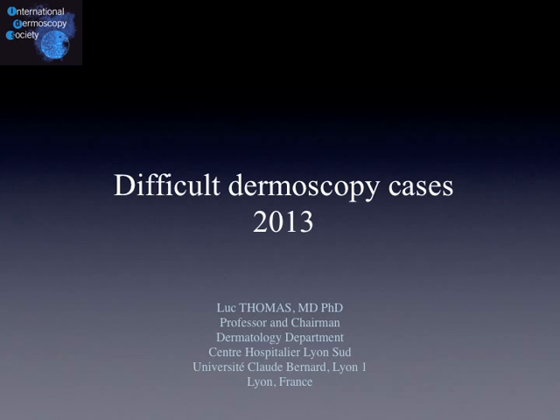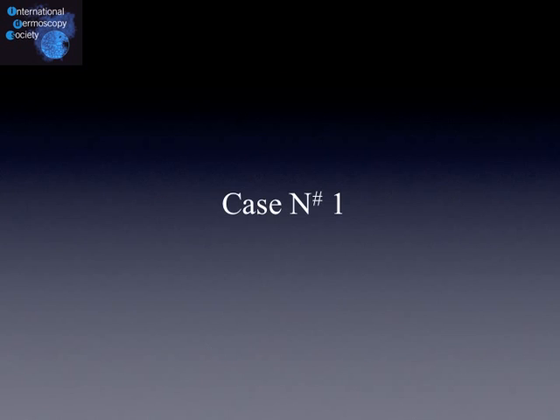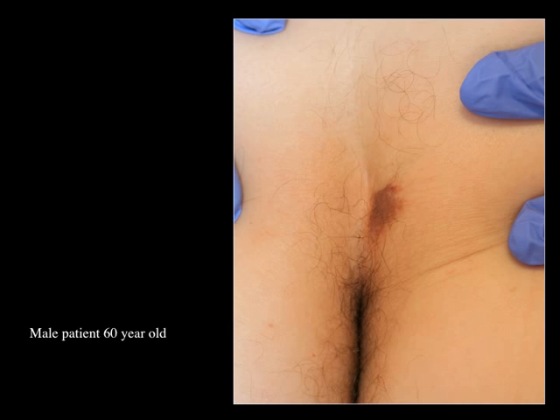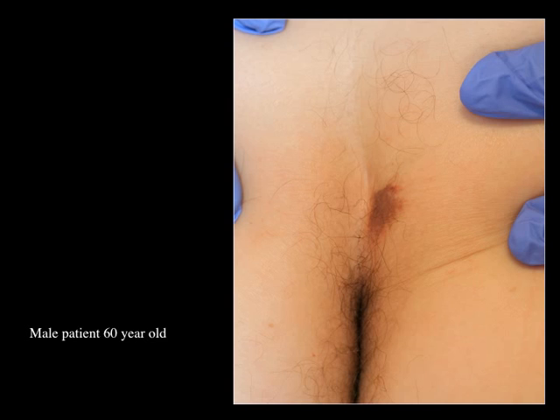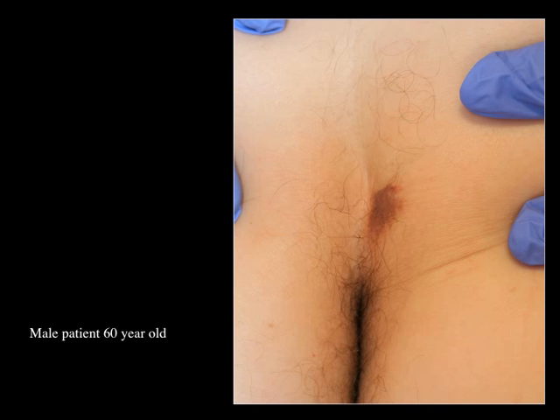Hello, this is Luke again. Here are my difficult cases for 2013. This is case number one: a 60-year-old male patient. We have no history of this lesion — it was discovered on systematic examination. It is on the upper part of the right buttock in the sacral area. The patient doesn't complain about it.